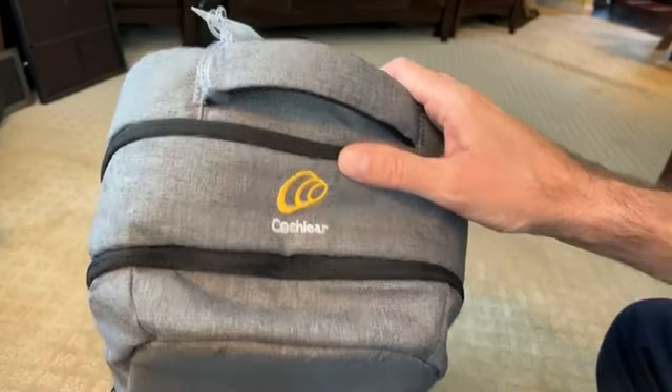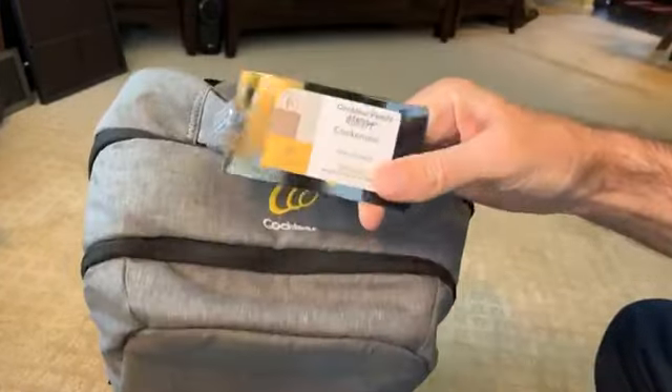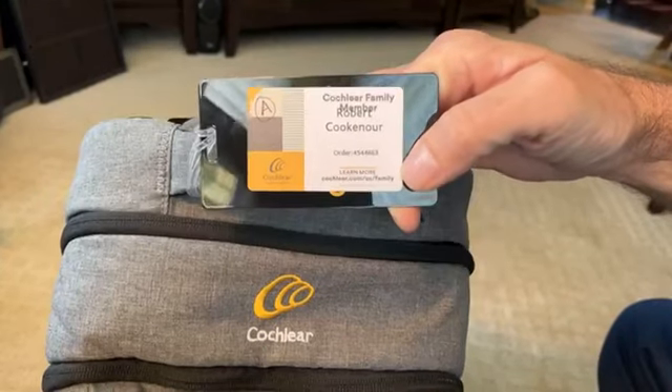So at their activation, she pointed out this was made specifically for little old me — here's your name, your brother, as it says, the Cochlear family.